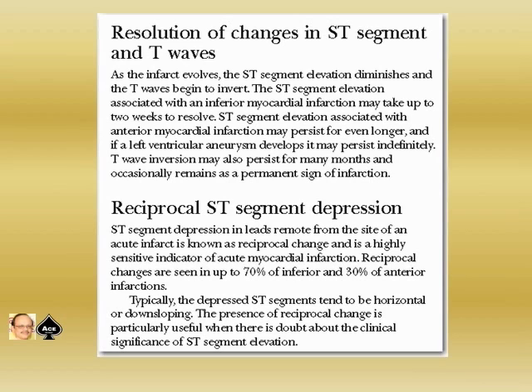The reciprocal ST segment depression. ST segment depression in leads remote from the site of an acute infarct is known as reciprocal change and is a highly sensitive indicator of acute myocardial infarction. Reciprocal changes are seen in up to 70% of inferior and 30% of anterior wall infarctions.